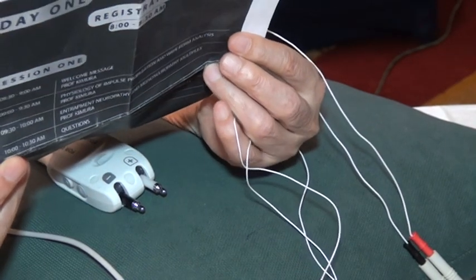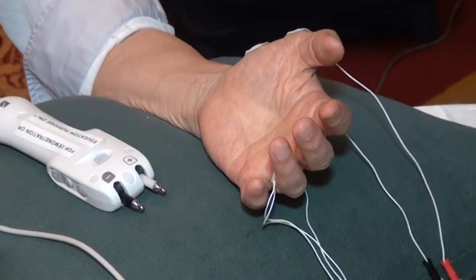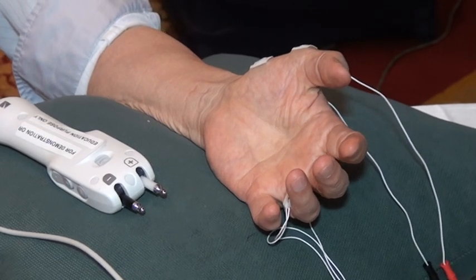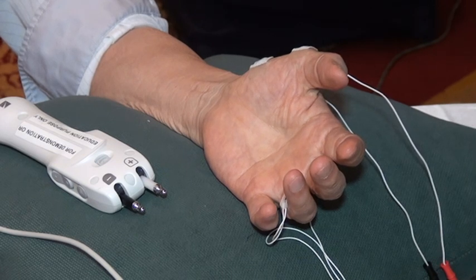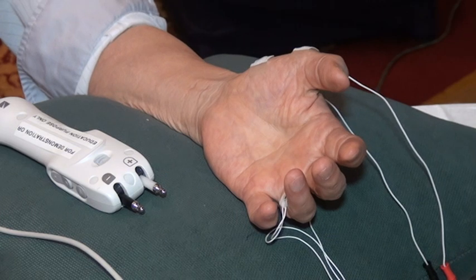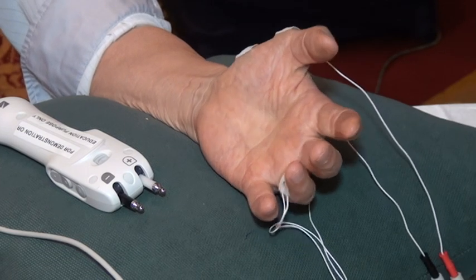Dr. Mishra will be talking about this tomorrow more. But how can you tell that this is not good? I think in the typical drop in the amplitude, we will see a U shape. Yes, you see this U shape, the drop in the fourth, down, and then coming up. I expect in the sixth or seventh there will be repair, and we will see a typical U shape. Yeah, but this is a U shape. This is perfectly U shape, down and coming up, plateau. So that is not the answer.